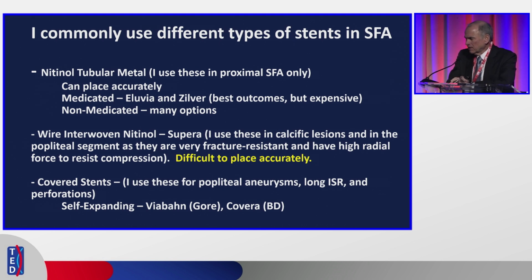So first off, we have the nitinol tubular metal, and I predominantly only use these in the proximal SFA. You can place these accurately in the proximal SFA. You're not as apt to fracture a stent.